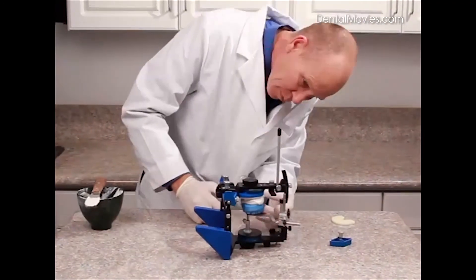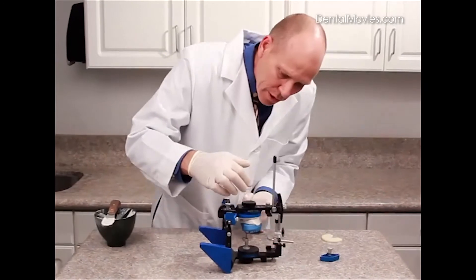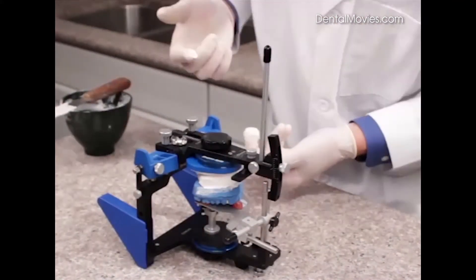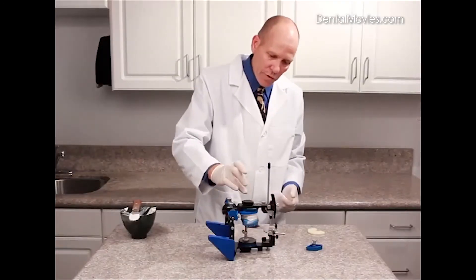If there's any plaster that's extended beyond the realm of the mounting plate, we can wipe some of that away at this time, and it'll give us some room to add plaster later to beef this up and make it look pretty. So we'll let this set at this time.